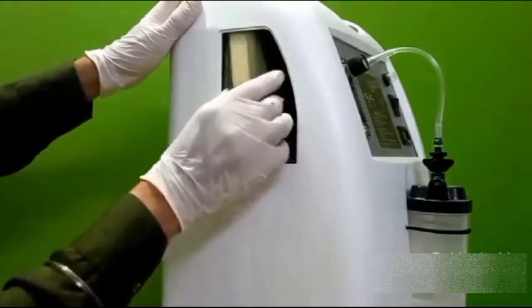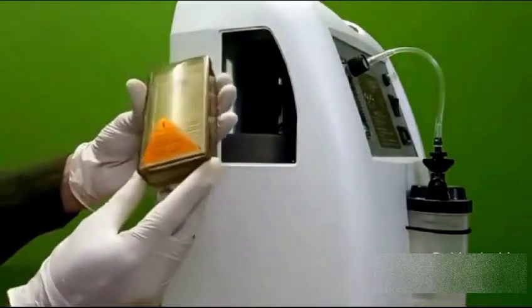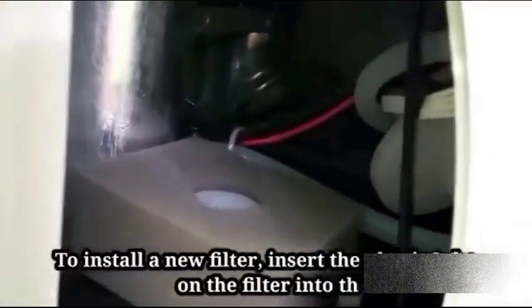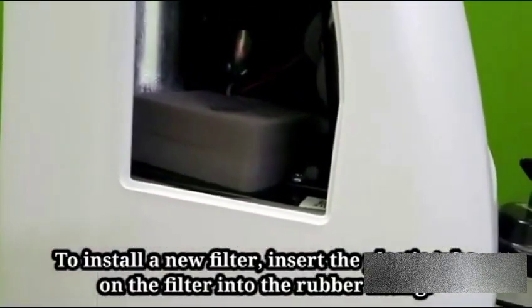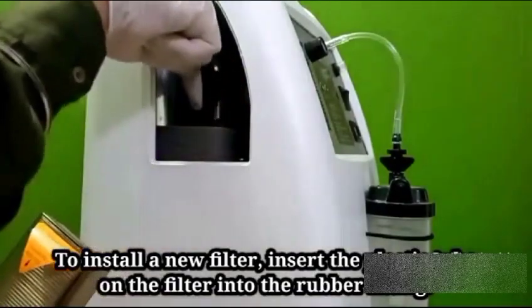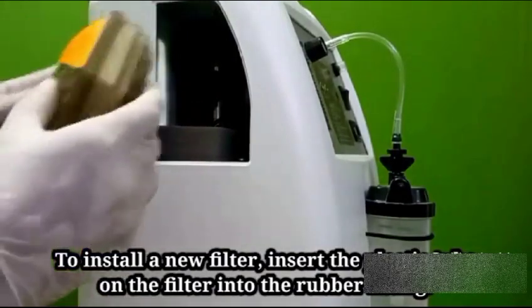We will take out this filter that remains. You can't wash this filter. You don't have to clean it. You have to replace it. It depends on how many dust particles are there where we are using it. Whenever you see this filter become colored, it will become black, from which it will be known that more dust has come in and it will not be able to filter, but you can see its condition. Apart from this, you will replace it.